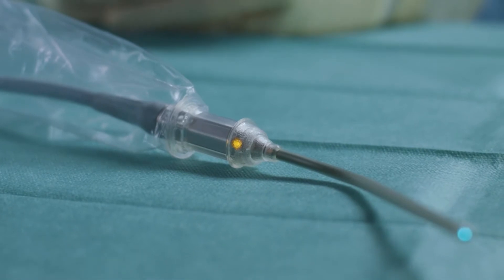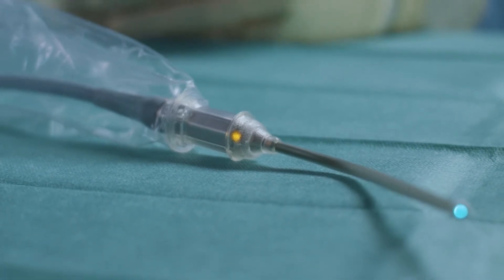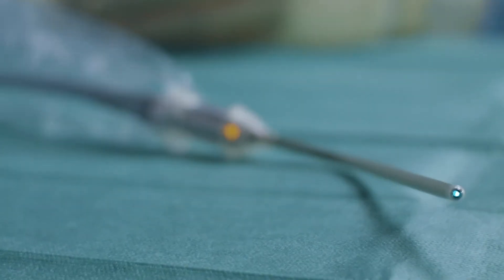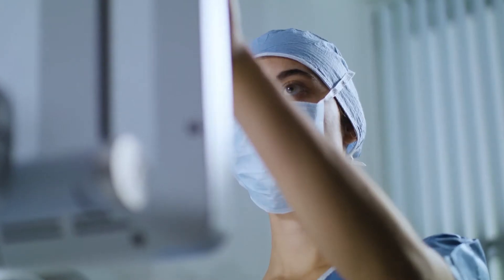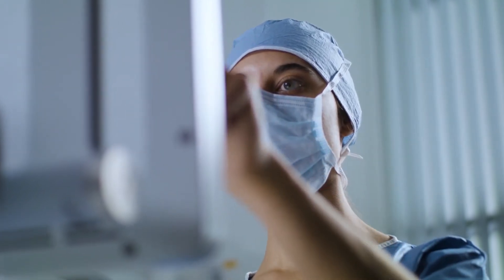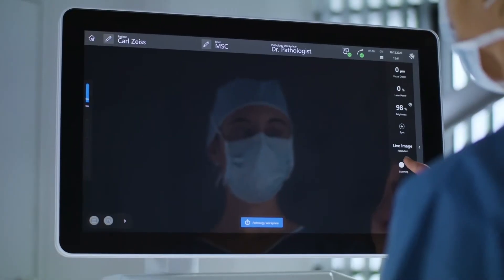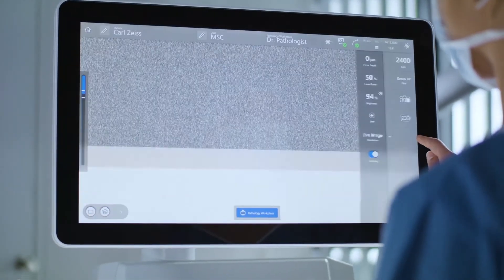The orange indication lamp on the probe of Zeiss Convivo shows whether scanning is switched on or off. To find the focus point of the Zeiss sterile sheath for Zeiss Convivo, switch on scanning and change the following settings.